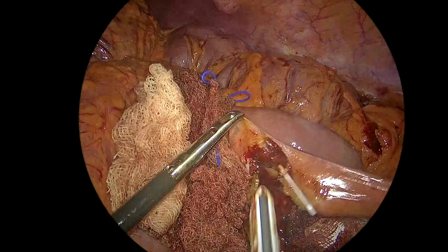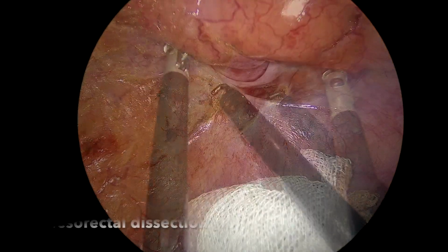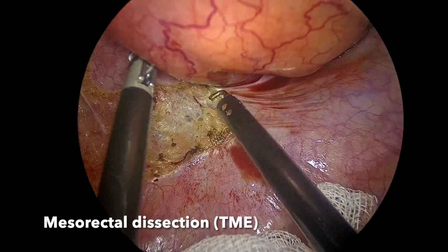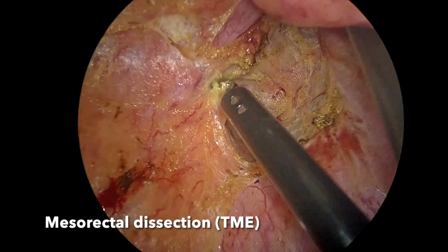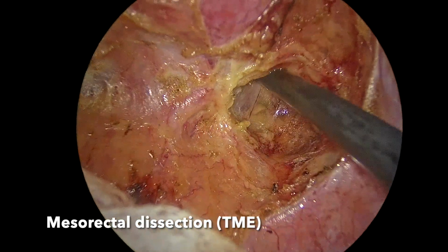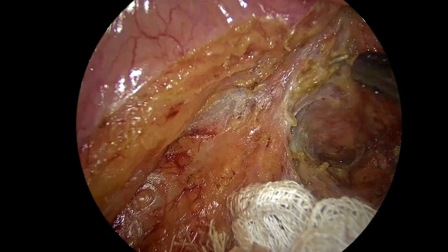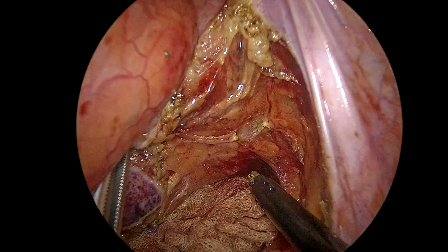Pelvic dissection is continued posteriorly while preserving the hypogastric nerve. The mobilization plane ultimately leads to an avascular plane between the mesorectal and presacral fascia, and dissection continues laterally on both sides for complete TME. During lateral dissection, the lateral ligament containing the middle hemorrhoidal vessel and splanchnic nerve branch are then divided.